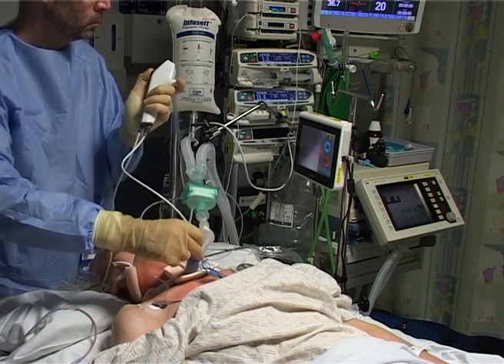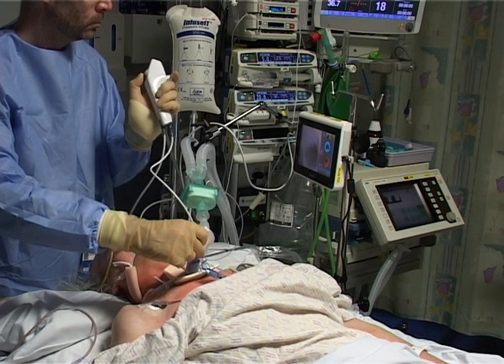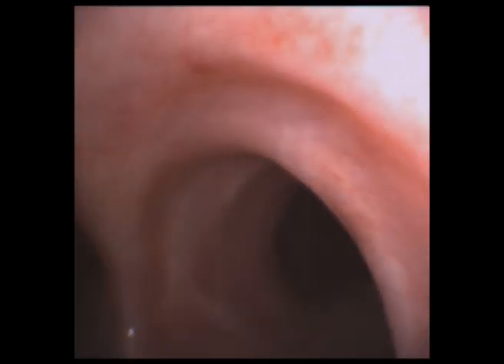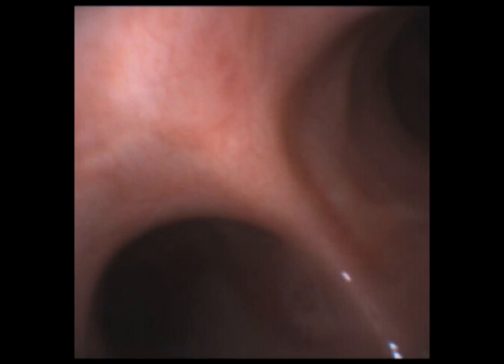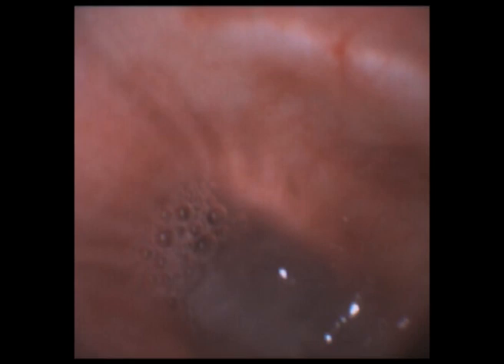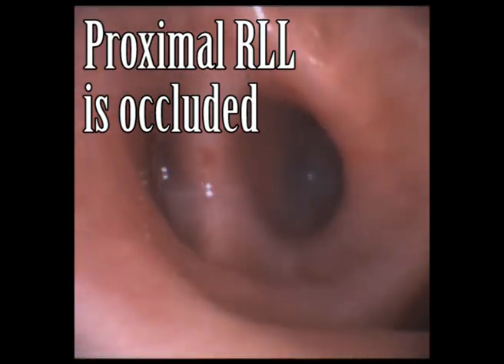Having reviewed the imaging, the bronchoscope is advanced to the area of interest. You can see on this clip that the right main bronchus is entered and the bronchoscope has advanced down towards the right lower lobe. Thick secretions can be seen, which are blocking the proximal right lower lobe.